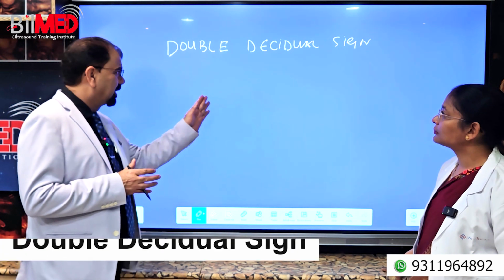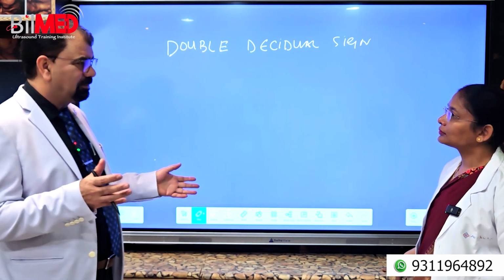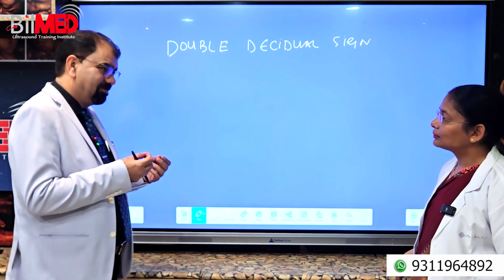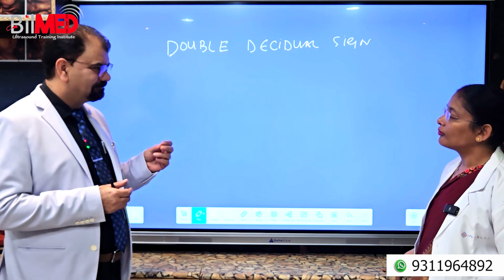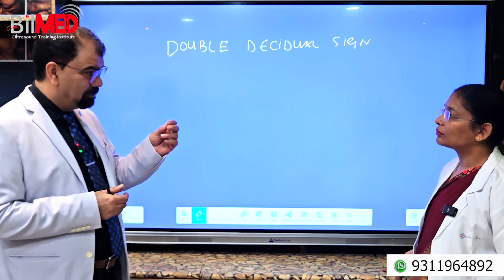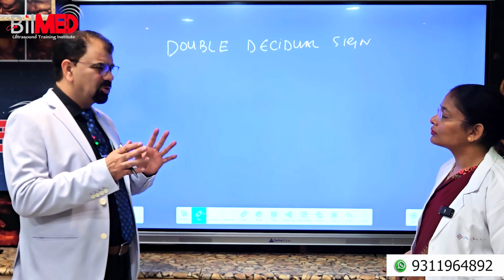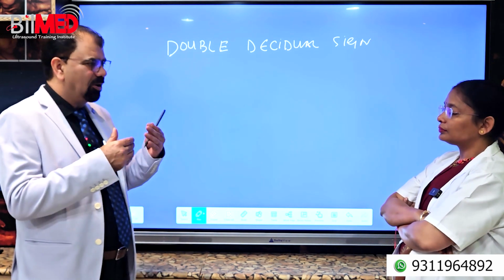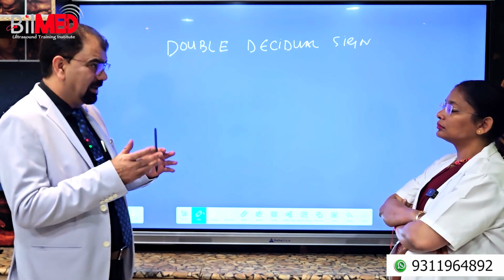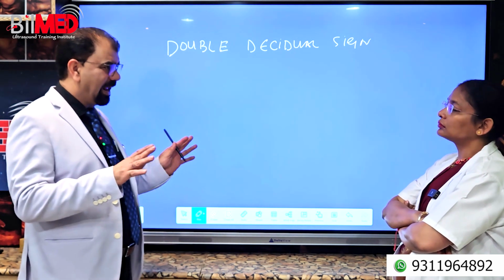If I tell you the definition of the double decidual sign, you will give me a very beautiful, fancy definition. But at the end of that definition, I bet, I am repeating, I am betting that most of the gynecologists and whosoever is doing the ultrasound are not, I will not say aware of what they are talking. It's not like that. But practically how that is on ultrasound, they are blank over there.